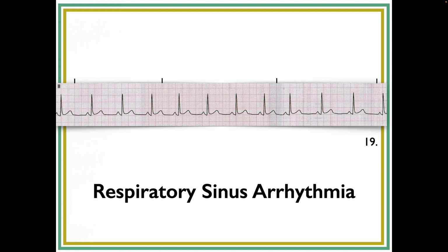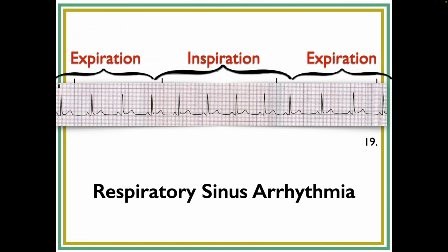You can see how the middle part is, so this would be expiration, the vagus nerve is being stimulated, inspiration, no vagal nerve stimulation.